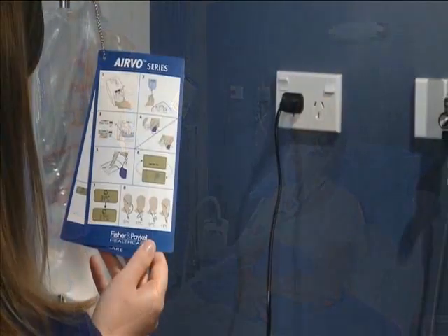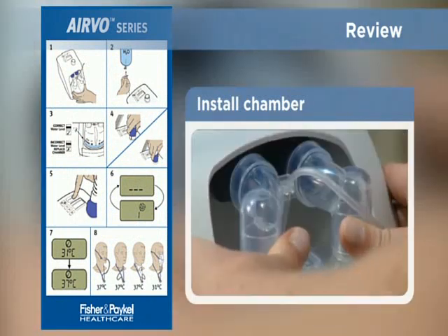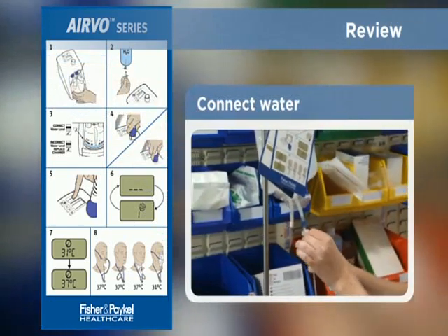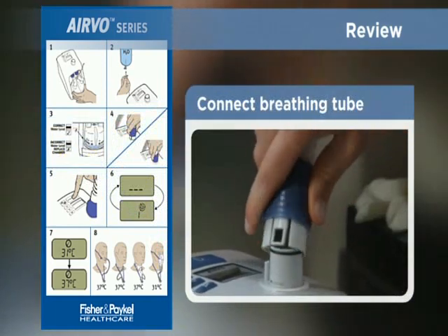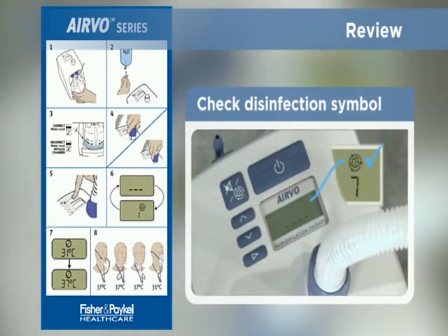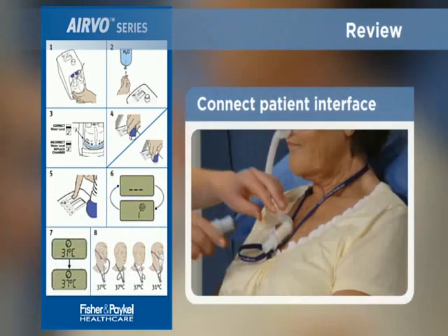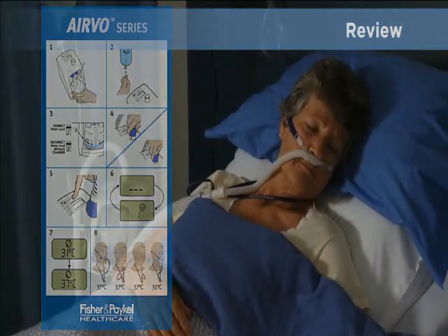The setup procedure is summarized on the Evo swing tag. Let's review the main steps: First, install the water chamber. Then connect the water supply and check the water level is below the mark. Connect the breathing tube, then turn the Evo on. Check that the disinfection symbol appears during warm-up. Confirm that the ready-for-use symbol is displayed. And finally, connect the breathing tube to the patient interface to complete the setup procedure.